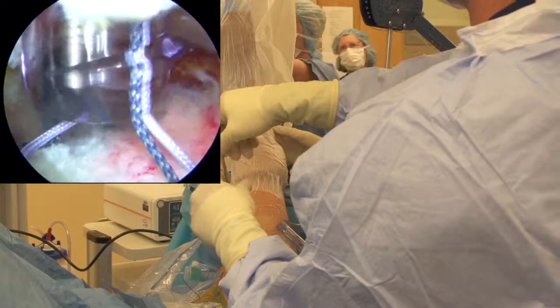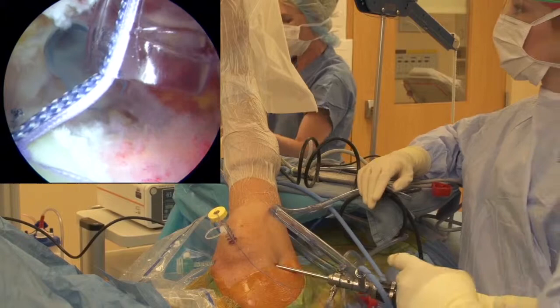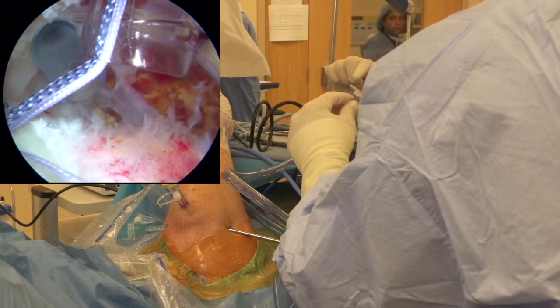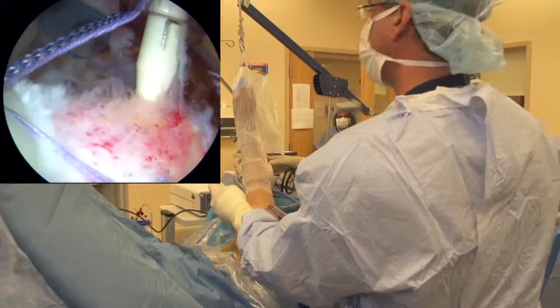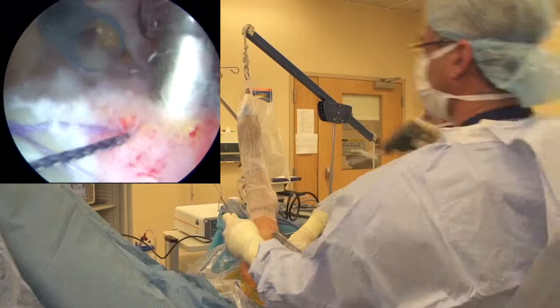We're going to repeat that process here in a second. Excellent coverage of that footprint. What I like about the double row repair compared to the single row is that extra compression of the entire tendon onto the footprint. Now you've got those nanofracture holes that are present there too, which are opening up to allow for some healing potential cells. So hopefully we're going to get a really nice bone-tendon interface that's going to allow for biologic healing, and I think the arthrosurface nanofracture technique aids in that biologic process. That's a nice spacing - I'm happy with that. I'm going to drive that straight on down. Good - we've seated our device.